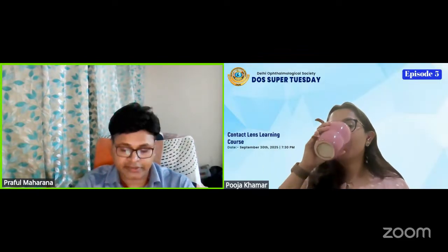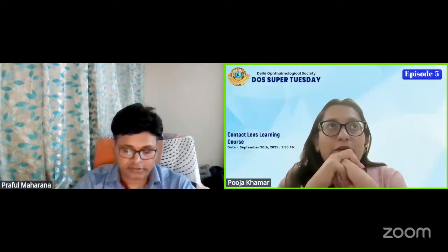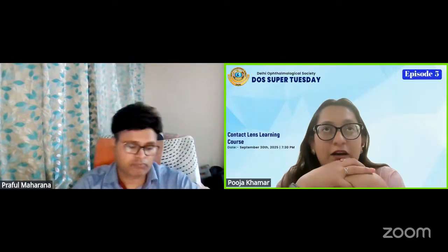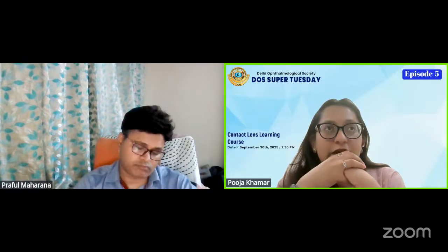Which of the heat therapies? I think you outlined that slide, right? Three, four options. Which one is best according to you? So there is thermal pulsation, or a thermal based therapy, and the other is IPL based therapy. As I mentioned, the thermal pulsation therapies work the best for evaporative and mixed type of dry eye disease. With LipiFlow, the concern is the cost, because it's the patient cost.